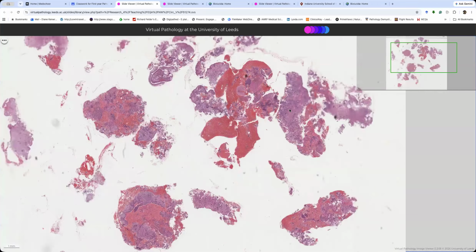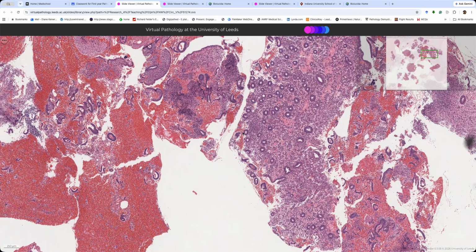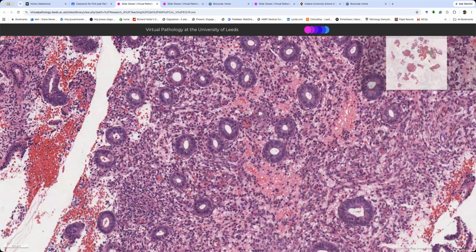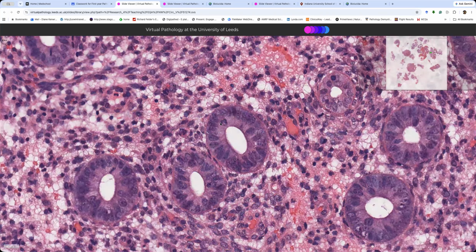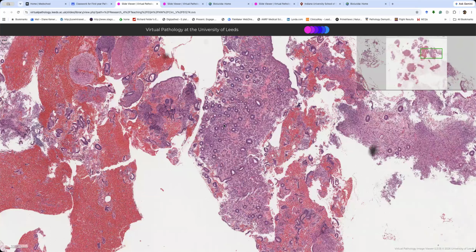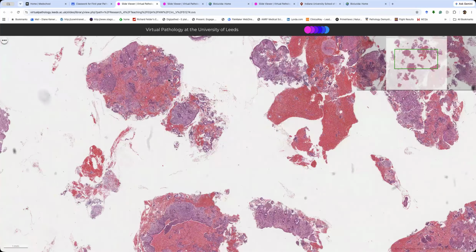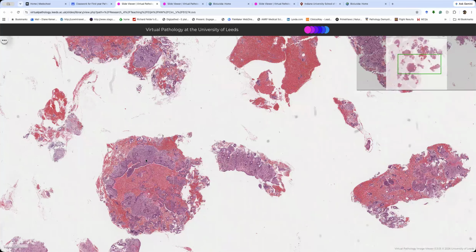All right, we're going to play also a game of pathology bingo. Every time I mention a food stuff, you can write a score, and I'm about to call these donut glands. So we have the donut glands here with the proliferative phase, and you can see the mitoses here. Okay, so what clue might we have that this might be endometritis? Because to be honest, I do not go and look at endometritis on every single biopsy. So there's the clinical clues, previous IUD.